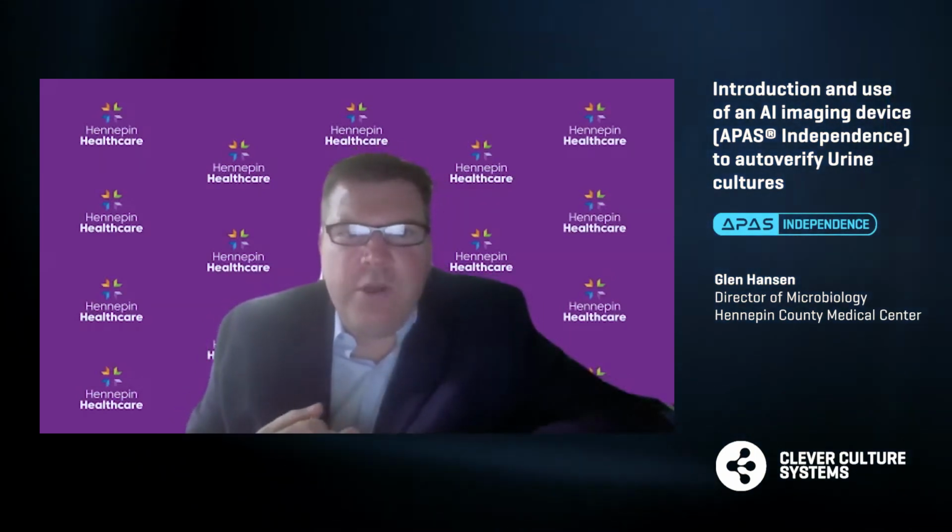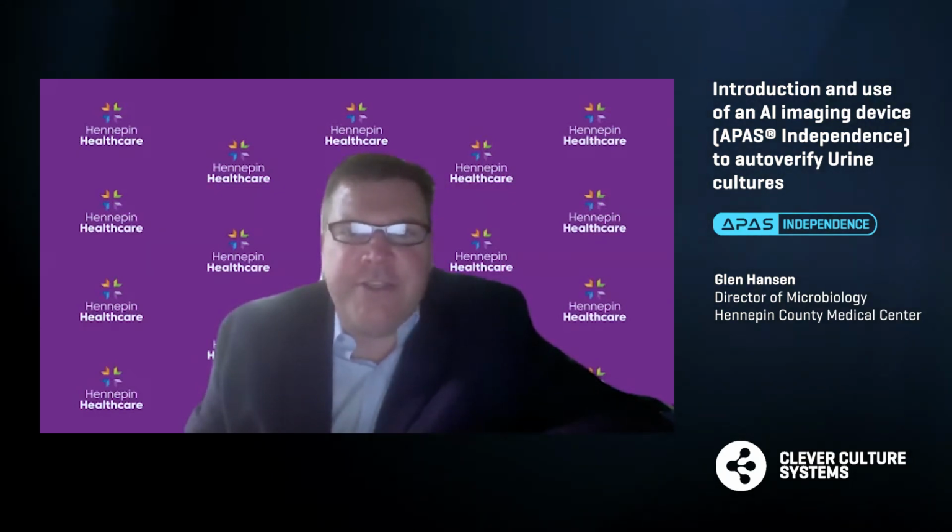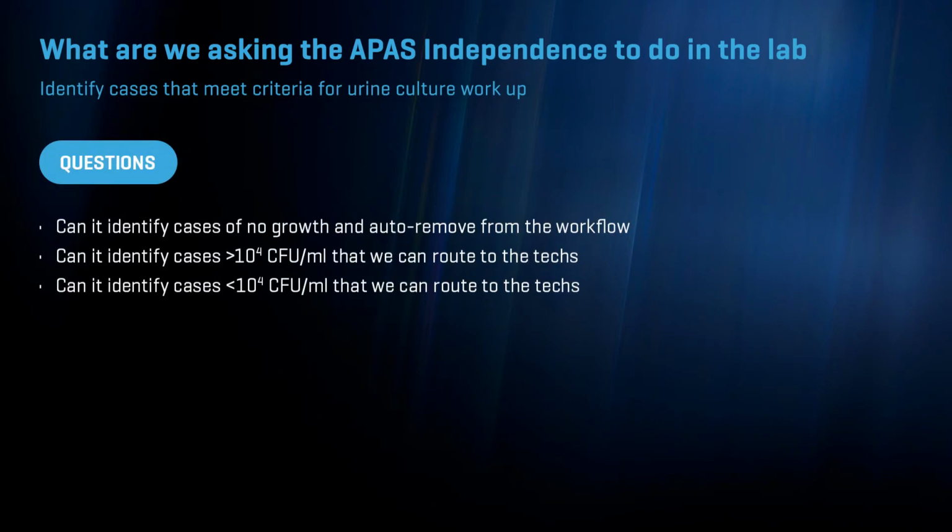So I think it's important that we ask in the clinical spectrum what we're asking our instrumentation to do in the clinical microbiology lab. When it comes to the APAS system, I think it's important for us to remember what the tasks are that we're looking for. So identification of cases that meet criteria for urine culture workup. And really we're asking three questions.